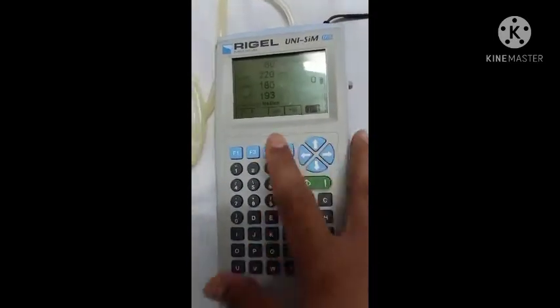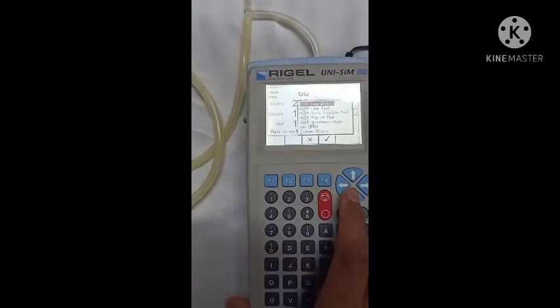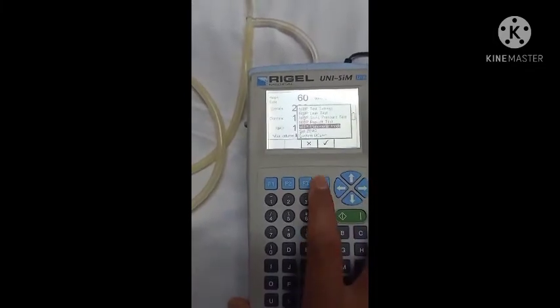Now we select manometer mode in our master. I have pressed the F3 key, scrolled down to manometer mode, and selected it using the F4 key.